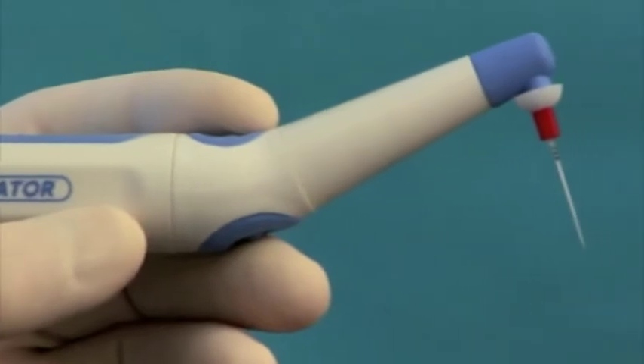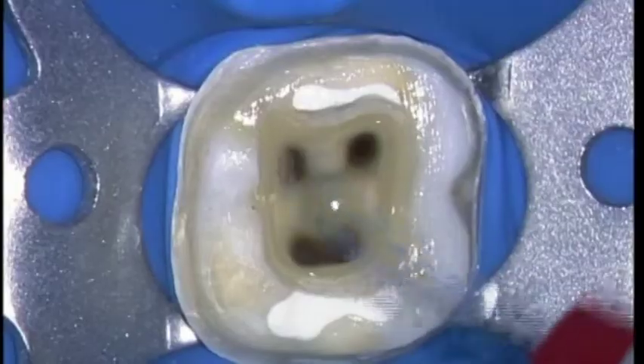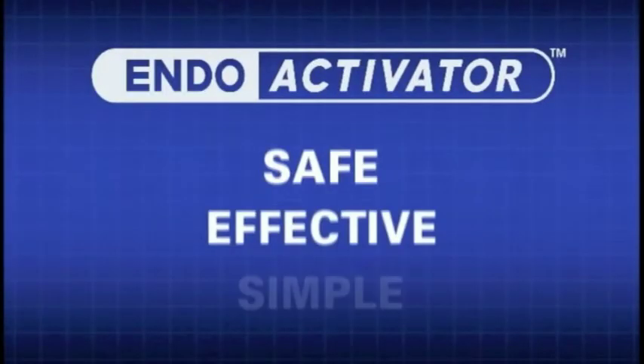The EndoActivator system is designed to safely and vigorously energize the hydrodynamic phenomenon. I encourage you to activate your endodontic solutions today with this easy-to-use technology. EndoActivator: Safe. Effective. Simple.